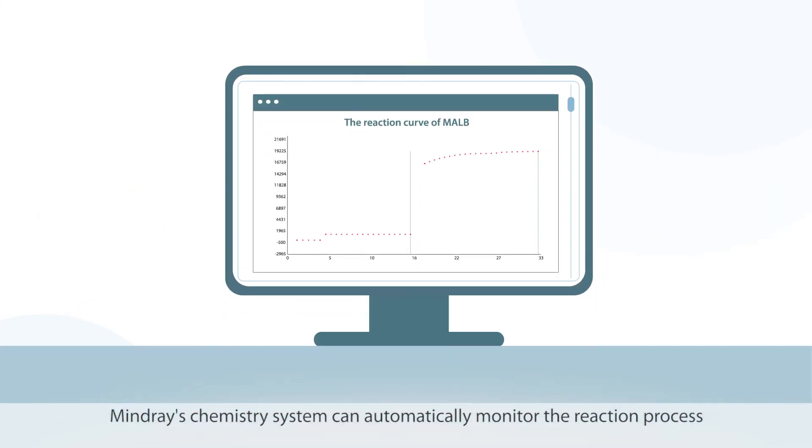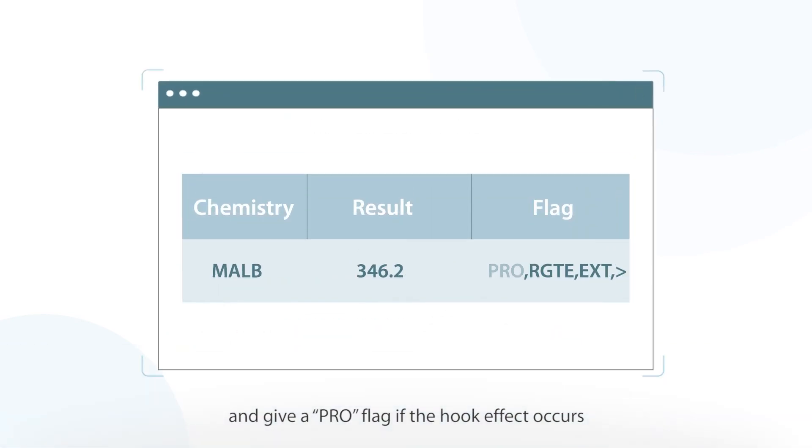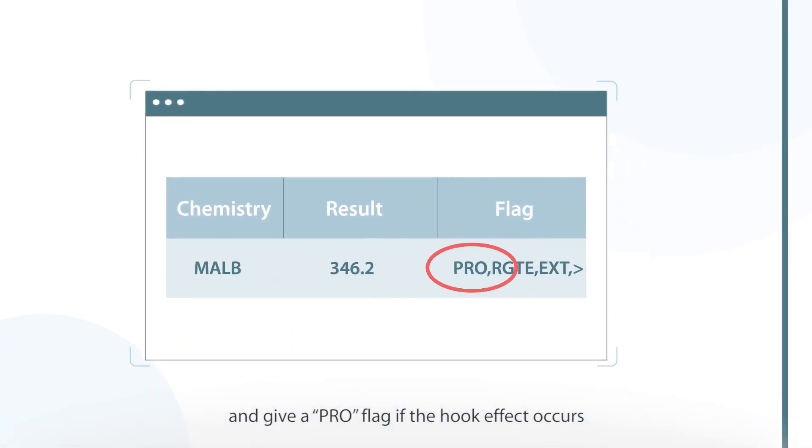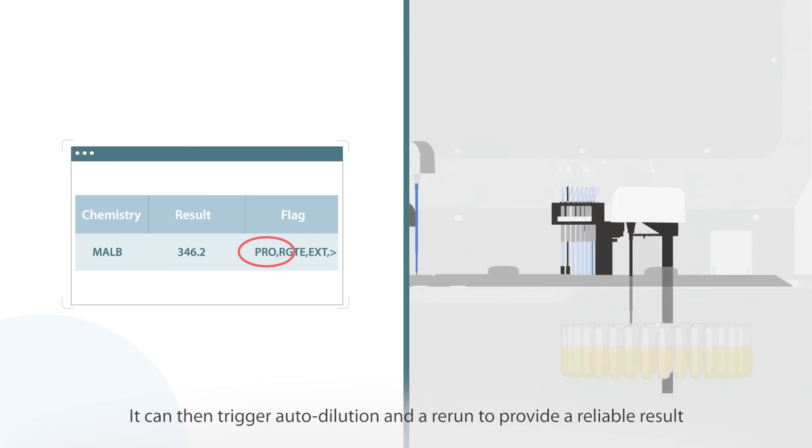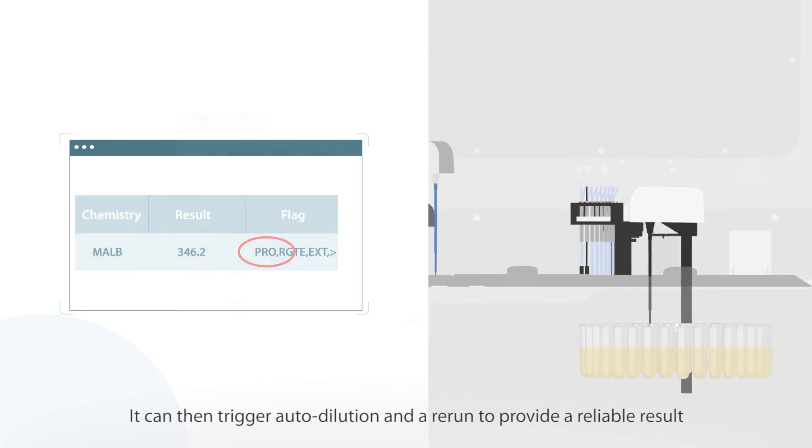Mindray's chemistry system can automatically monitor the reaction process and give a pro-flag if the Hook effect occurs. It can then trigger auto-dilution and a rerun to provide a reliable result.